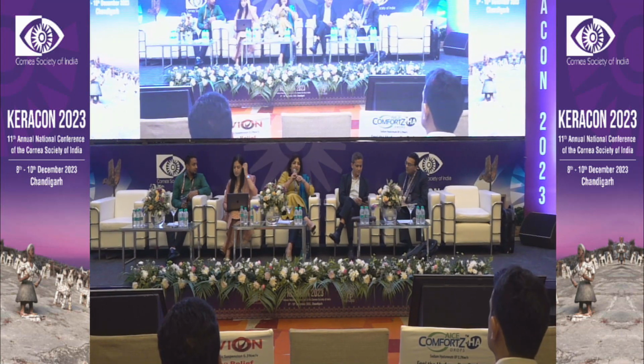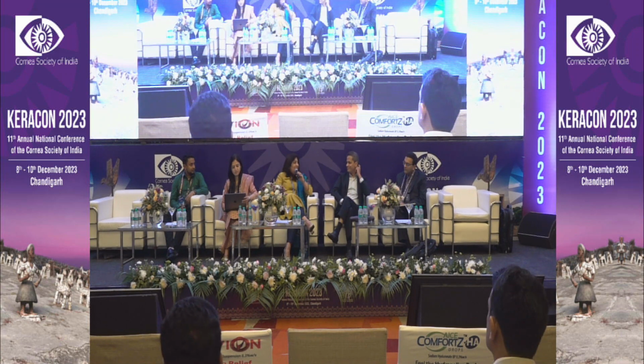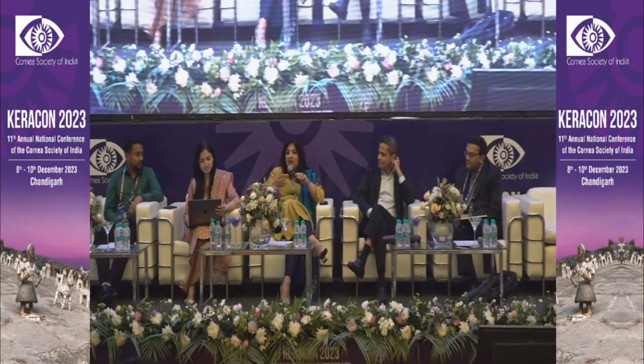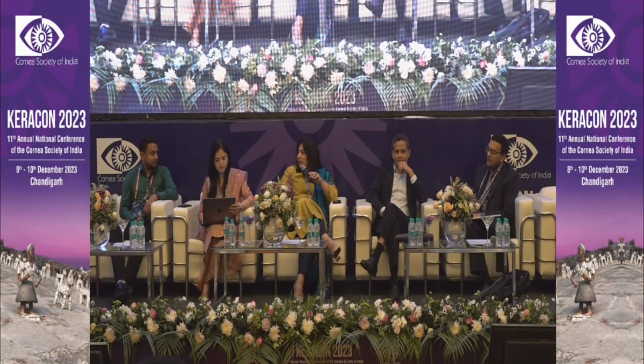No, at least in my view, doing a confocal for all cases would be a little bit of an overkill. It's also a little time consuming, and confocal is very, very operator dependent. Your results depend on the skill of the operator as well, so all studies recommend one person who's dedicated to doing this. But in cases where one is not getting results on scraping, because cultures sometimes take a long time, and if you have access to it, then in whichever case looks a little atypical, definitely I would go ahead.